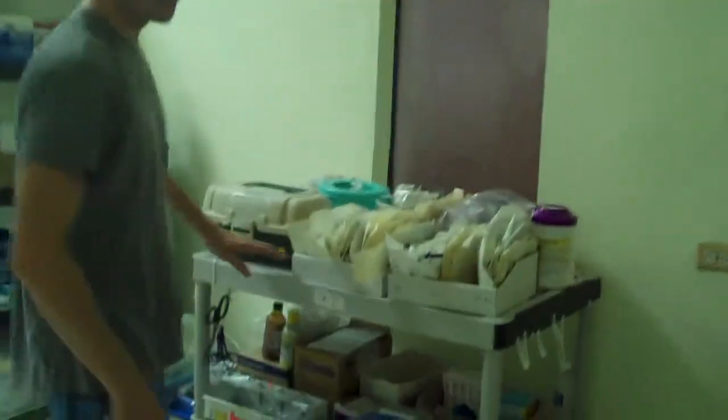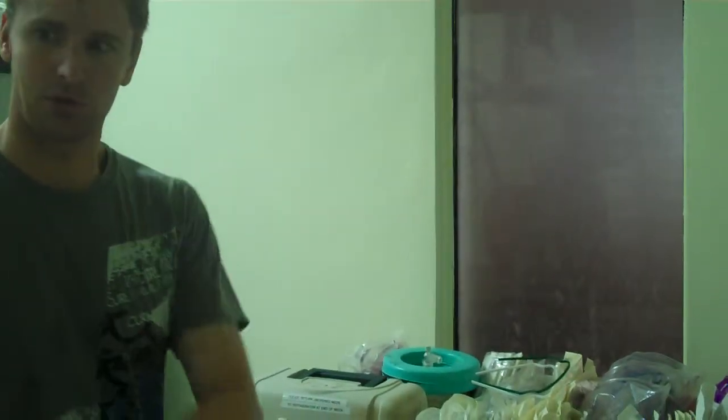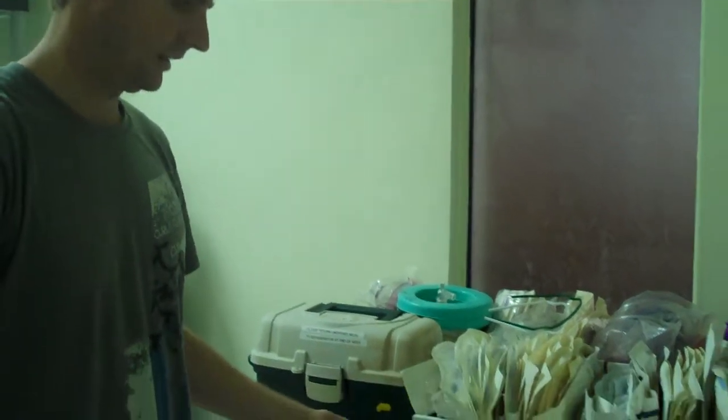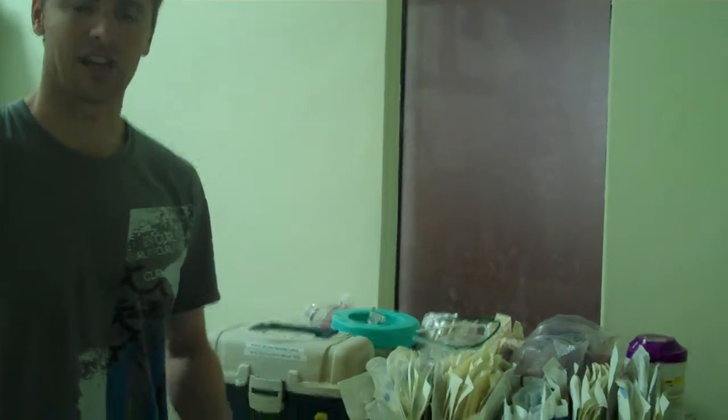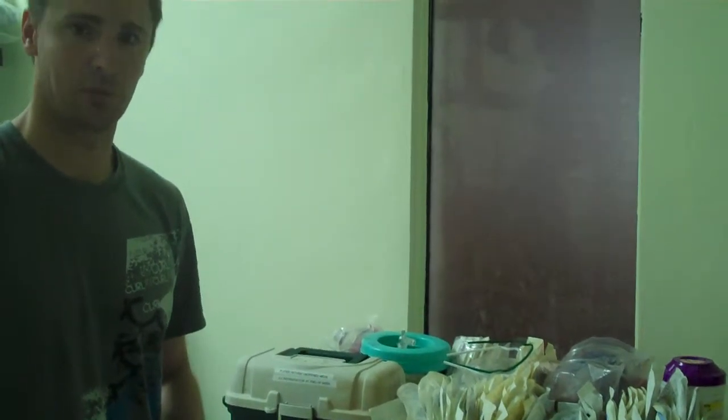This is your anesthesia cart or station. By the time you arrive, this should have wheels on it and you'll be able to move it from one side of the room to the other, so as to facilitate whatever type of surgery you're doing and whatever setup is most appropriate.